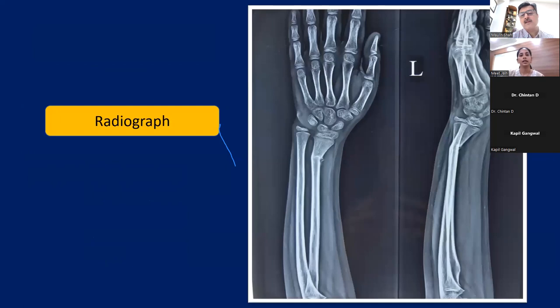These are her radiographs showing a Galeazzi fracture, AP and lateral view. So now, Deepak, do you agree that this is Galeazzi's?